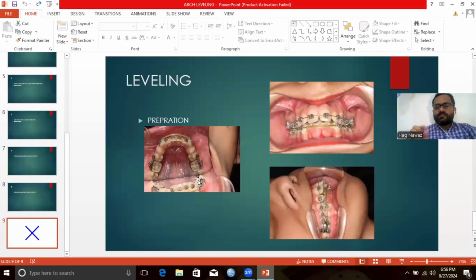Start the mandibular arch with separate segments. You are making a separate segment of incisors, aligning them, not leveling, aligning them to the heavy wire, and the right and left segments, aligning them with one single continuous arch, bypassing the incisors, having an archwire sleeve so that it is comfortable for the patient, and double tube band bonded with lingual arch. This patient is now ready for the intrusion arch to be placed. We will have a practical demo of how the intrusion arch is made and how it is activated.